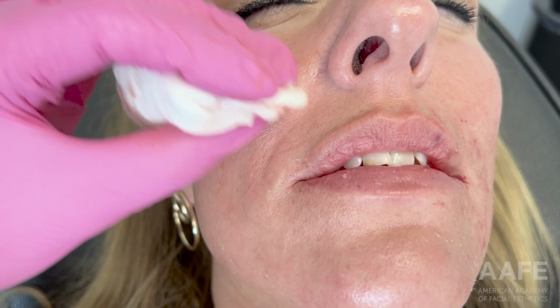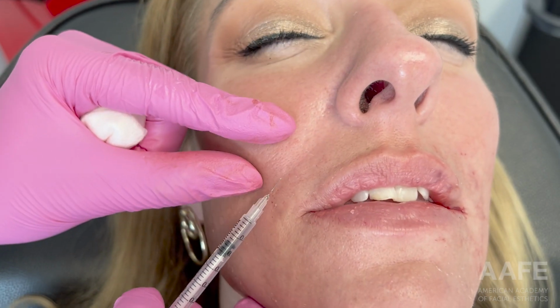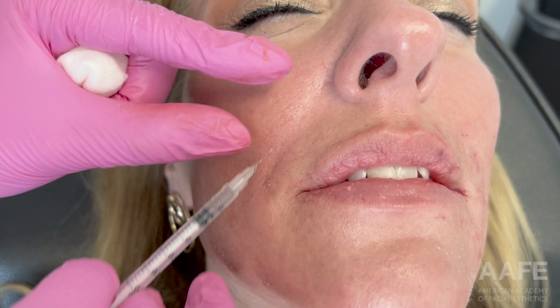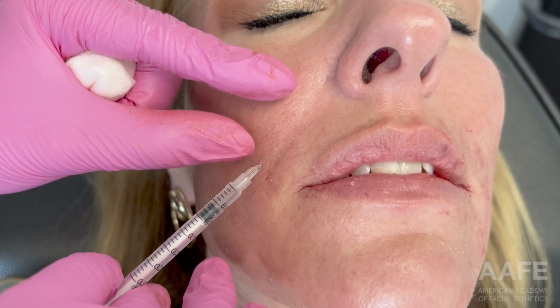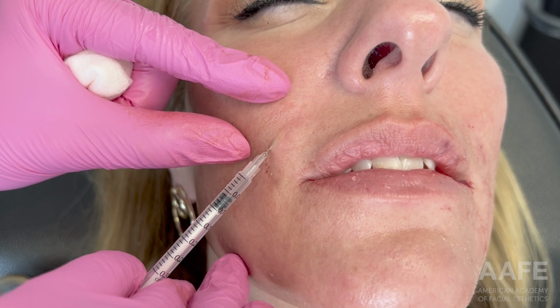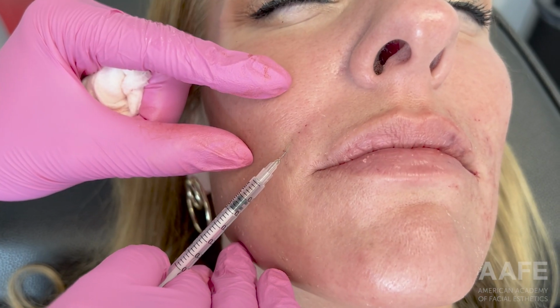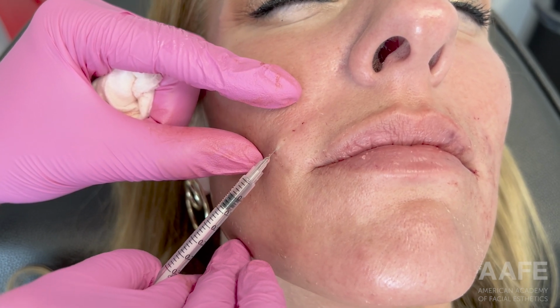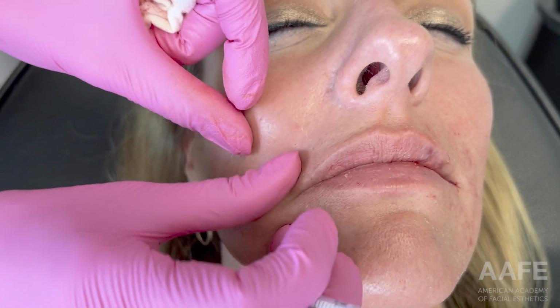Make sure you know your anatomy in this area, your depth, what you're trying to avoid, what you're trying to look out for if you had any concerns. So that's always huge. I do know my anatomy well, so I was not concerned with my depth. But you should know kind of what arteries you're trying to avoid, where you would see blood flow moving if you had any obstruction, what to do, what product you're using. And I'm really not putting a ton of filler here either.